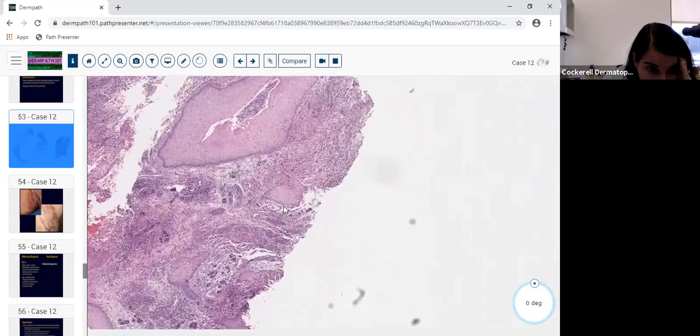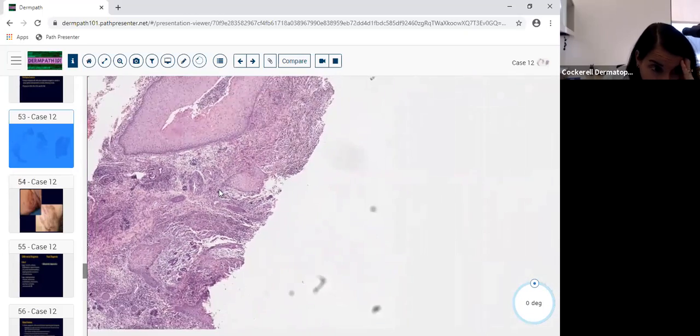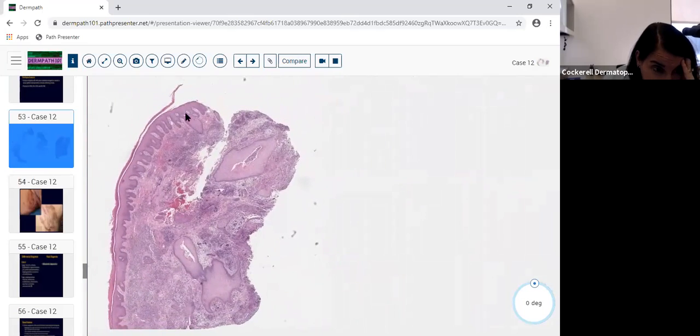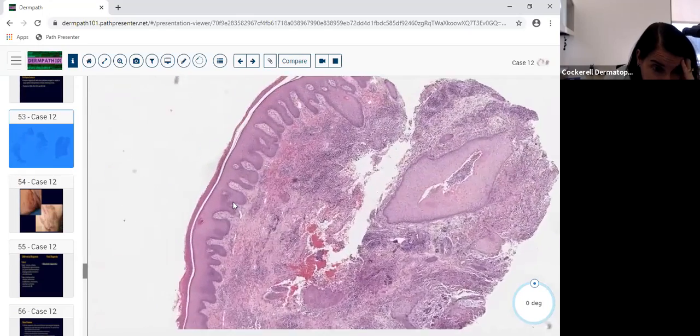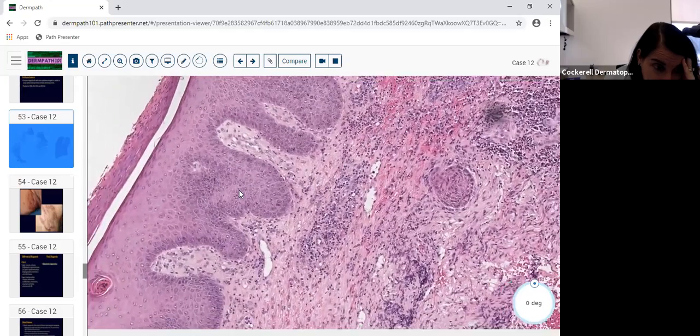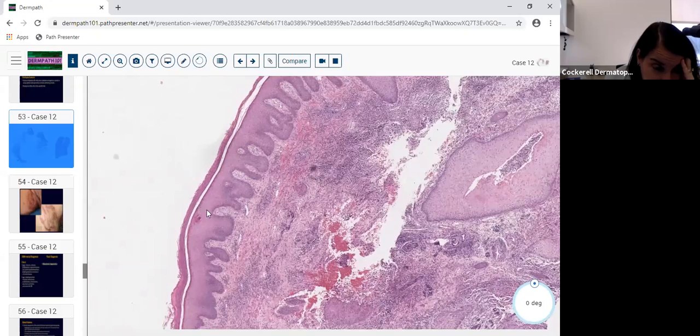And then here are portions of follicles. I mean, don't call this a keratoacanthoma. Oh, brother, that would be a big mistake. If you're worried about that, then I would definitely look at the overlying epidermis and see that there's absolutely no atypia. This isn't psoriasis; the suprapapillary plates aren't thinned.